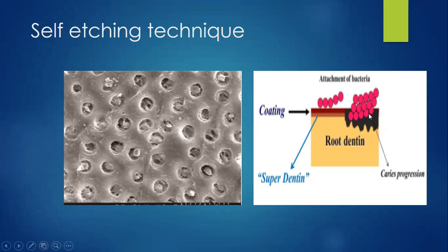It can be used for the protection of the tooth structure. After we prepare a tooth structure for indirect restoration, it has been said that they can be used for the protection of the lower dentin and can prevent secondary caries. This film coating is based on all-in-one adhesive technology, which is based on self-etch. It will form a barrier-like film on the prepared dentine. Like this is a prepared root. I have cut a cavity, and over that prepared dentine, if we apply a layer of self-etch all-in-one, it can serve to protect the dentin structure after the preparation.